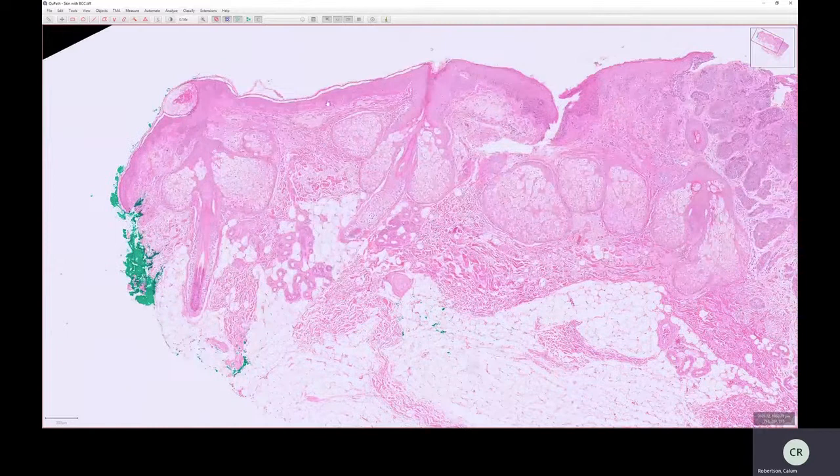So up at the top, we've got our epidermis, which is a form of epithelium. It's keratinizing on the surface, keratinizing stratified squamous epithelium. So that's the epidermis. We've got the modified epidermis coming to here. This is the hair follicle. We've got this glandular epithelium here. This is the sebaceous glands. We've got more glandular epithelium here. This is a sweat gland.